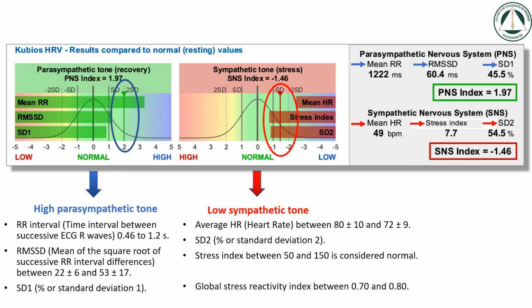The recording overview includes an illustration of HR, RMSSD, and stress index time trends, graphs of time dedicated to each stress zone, and energy expended, that is, basal metabolic rate and energy expenditure related to activity.